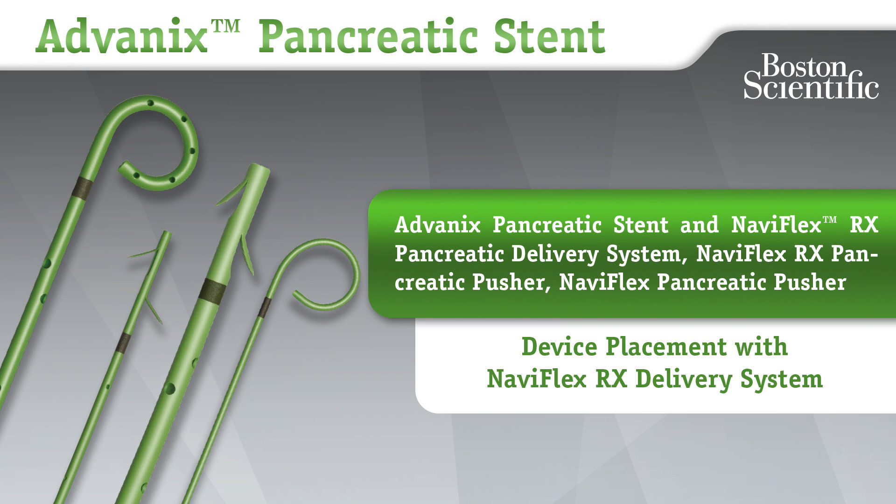Advanix Pancreatic Stent and Naviflex RX Pancreatic Delivery System. Naviflex RX Pancreatic Pusher, Naviflex Pancreatic Pusher. Device Placement, Naviflex RX Delivery System.